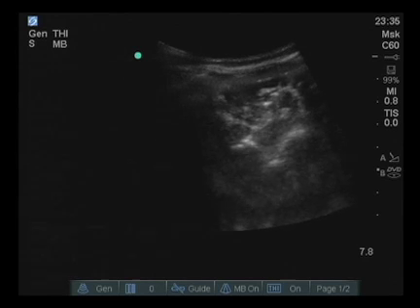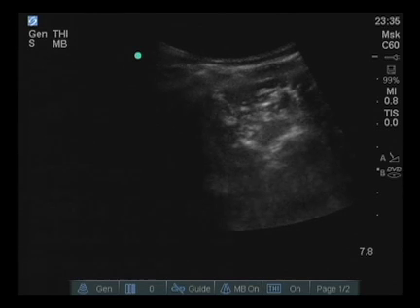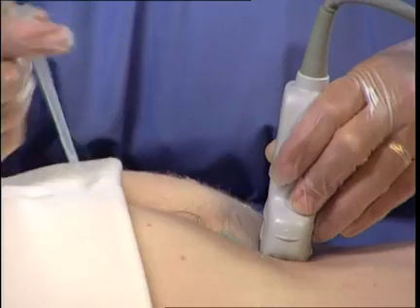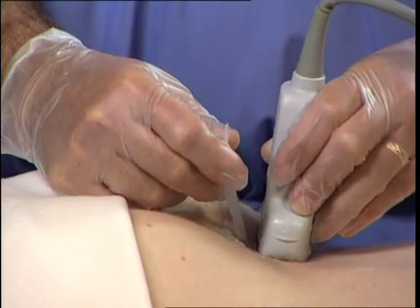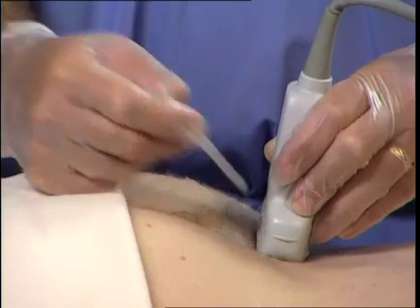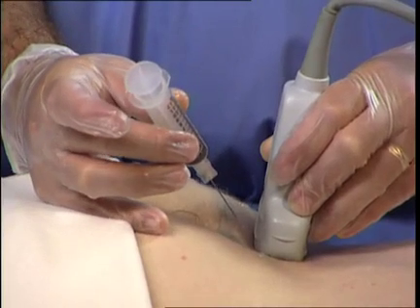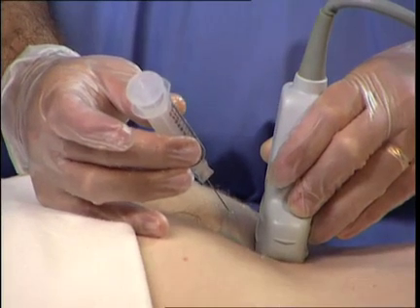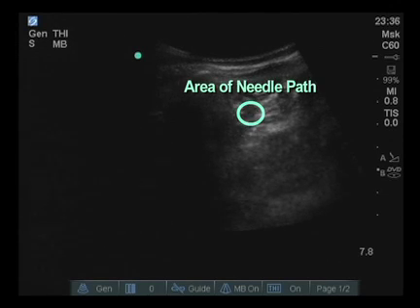It is important to remember that the iliac crest and the ilium folds and cantilevers towards the sacrum. Therefore, the needle angle needs to track from medial to lateral into the space identified in the center of the screen. Local anesthetic is placed. And as a finder needle, this injectate using hydrodissection demonstrates the needle tip at all times. The needle is going in the short axis, therefore it won't be completely visualized on the screen. However, hydrodissection can help notice where the tip is at all times.